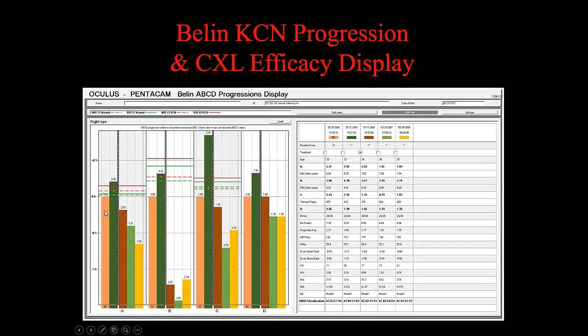So you can see in this patient, from a relatively short period of time, a statistically significant change on the anterior surface, a statistical change in the posterior surface to the 80% level, and a highly statistically significant change on corneal thickness. Patient underwent treatment and actually did very well.